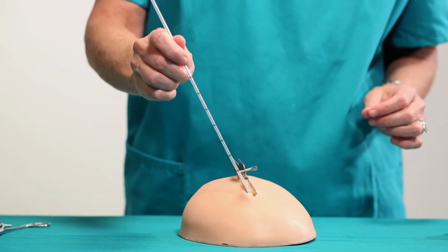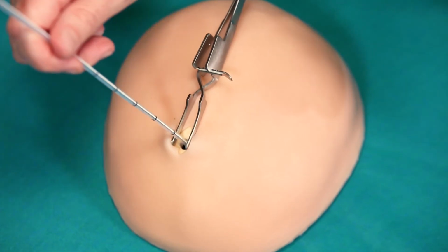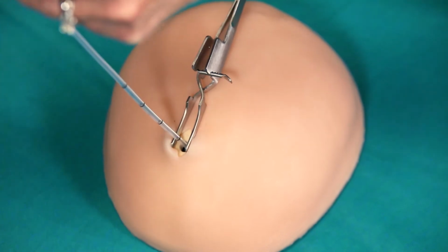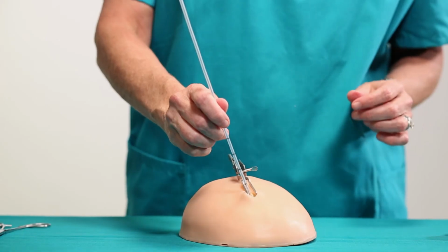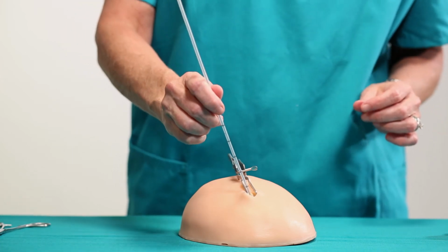Take the ventricular catheter with the guide wire in place and advance it slowly but steadily through the burr hole into the parenchyma. The trajectory should be towards the ipsilateral medial canthus of the eye, and the catheter should be exactly perpendicular to the skull. Advance the catheter 5.5 to 6 centimeters from the dura mater.